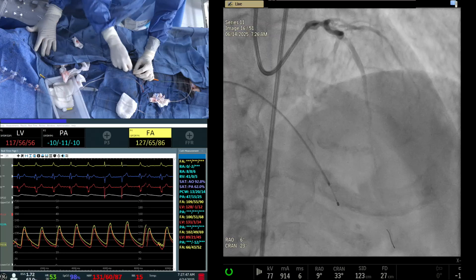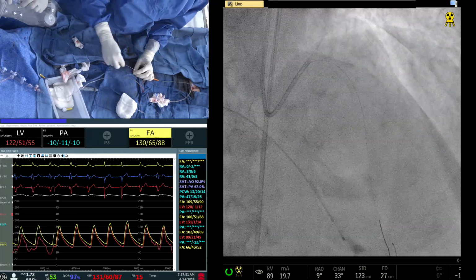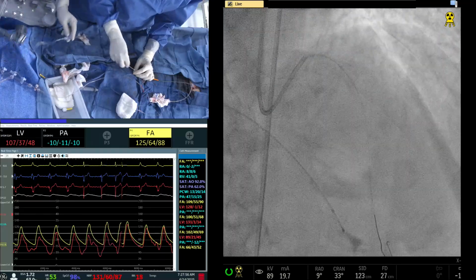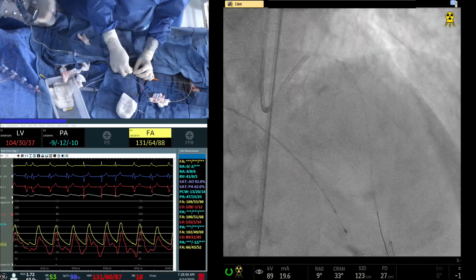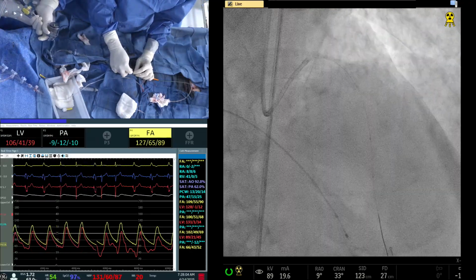To be fair, if the patient is in India, most of us would have ballooned it and done a DCB for the distal LAD. Then that option is not there in the US at present. No, we have. So the only question is the cost issue. Native vessel, you can use it. So question only is the price.